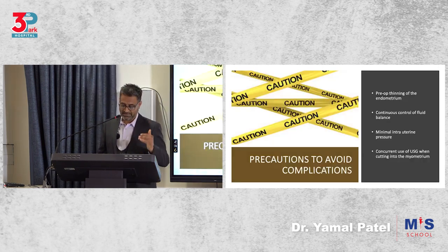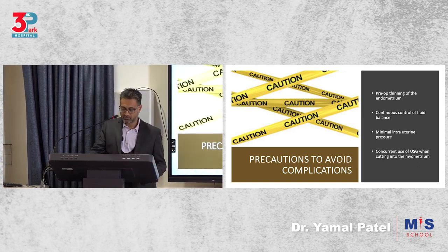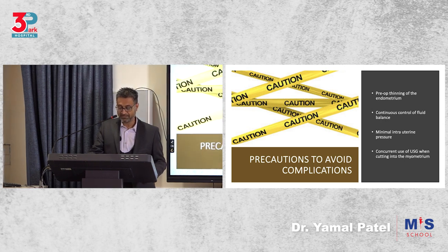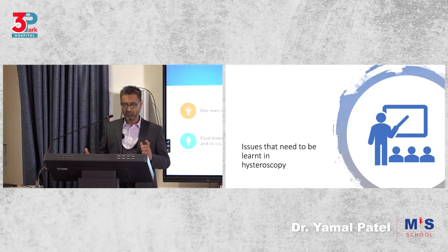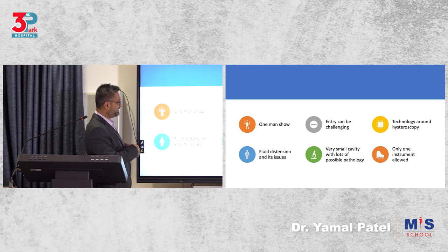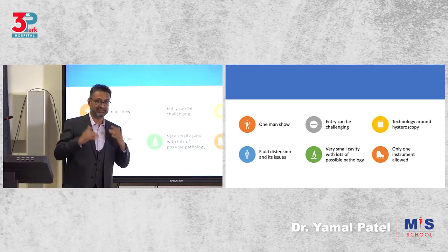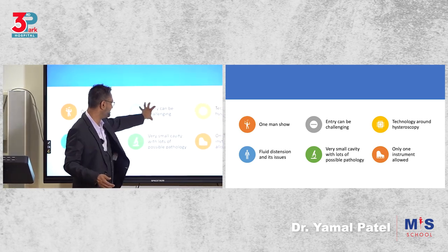Precautions to avoid complications: try and thin up the endometrium before, get good continuous control of fluid balance, and the pressure should be maintained to a minimum, etc. So what are the issues to be learnt in hysteroscopy? Remember, it's a one-man show. The most challenging part is the entry. If you do your entry properly, the rest is okay. This is where people get stuck.